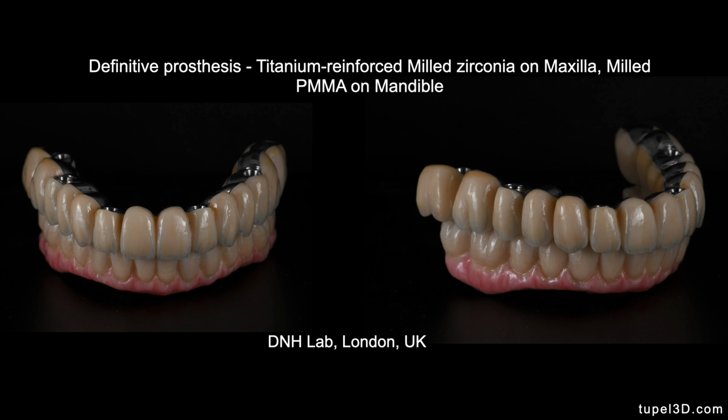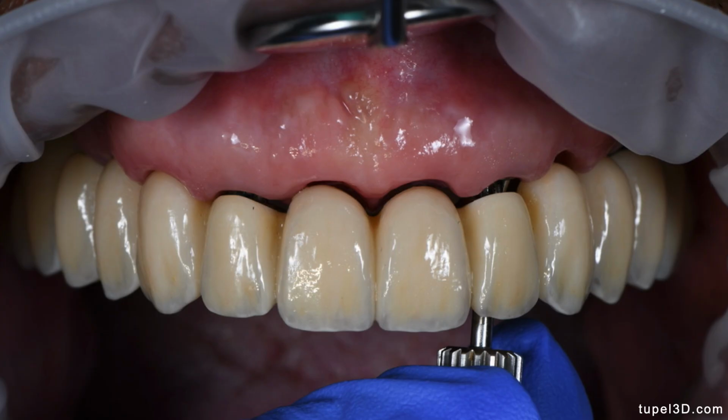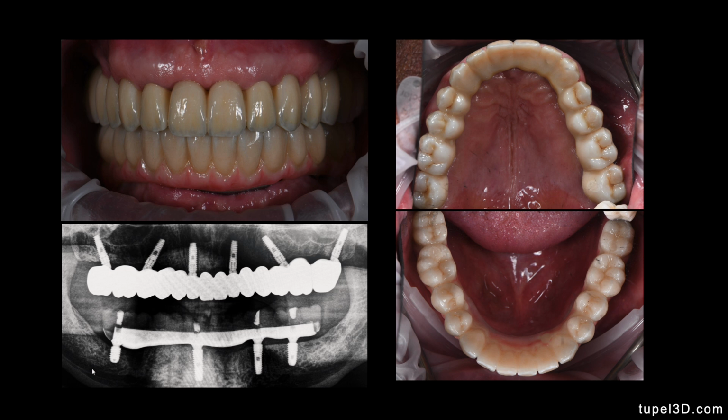Okay, and the case was completed with a titanium-reinforced milled zirconia on the maxilla and a milled PMMA on the mandible. And this is the case finalized. You can see there's complete passivity of the prosthesis. Okay, and this is quite a big arch that's been restored.